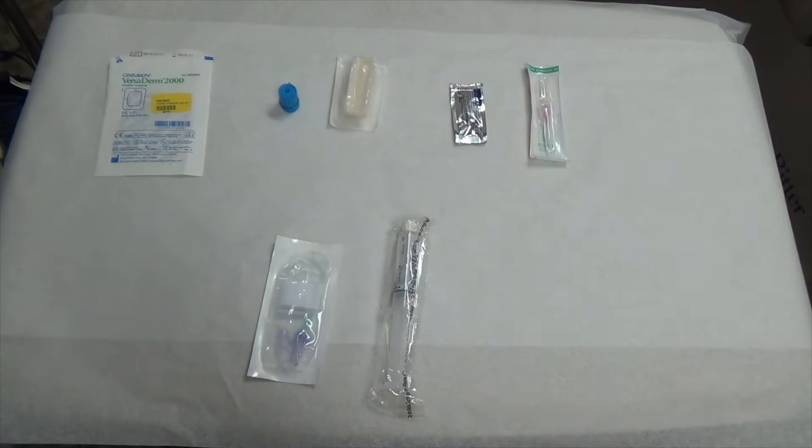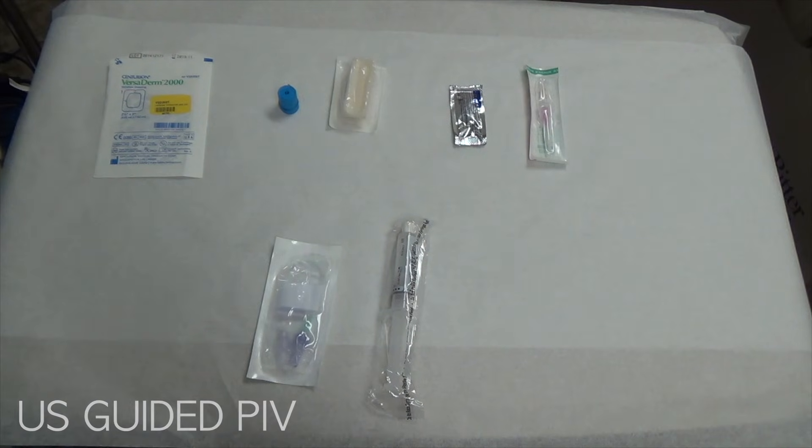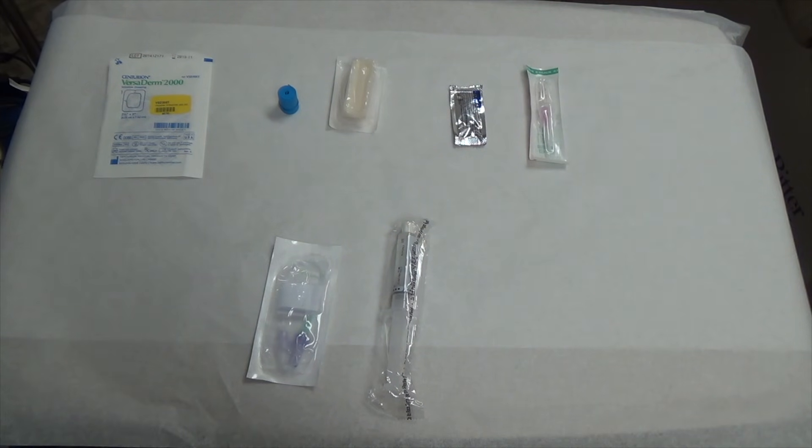In this video we're going to go over how to place an ultrasound-guided peripheral IV, and these are the materials that you're going to need.